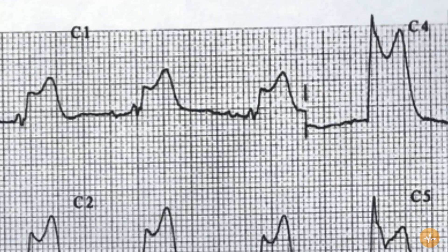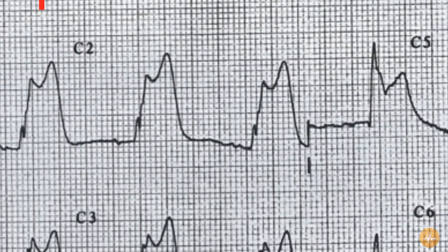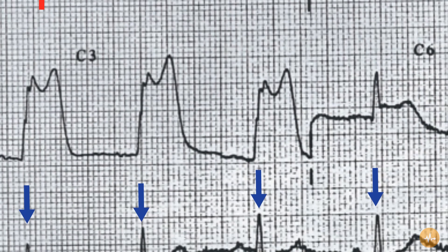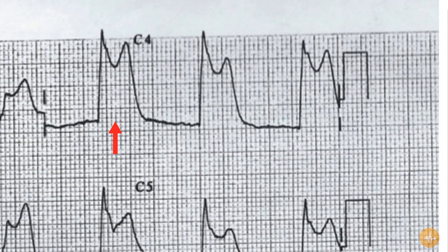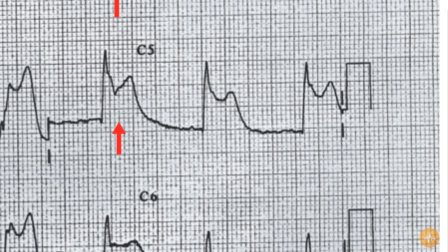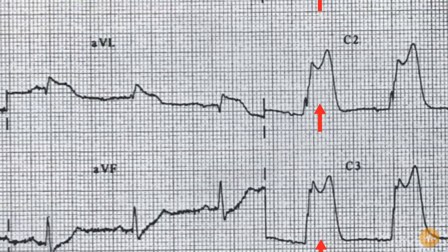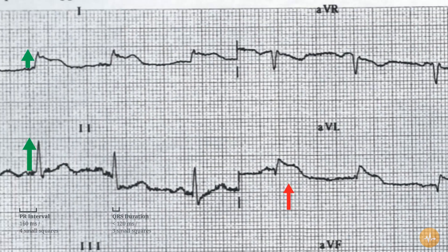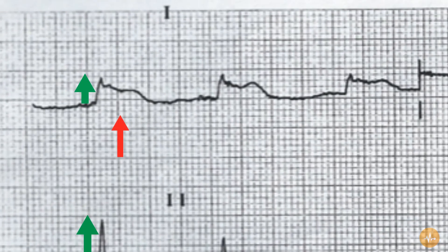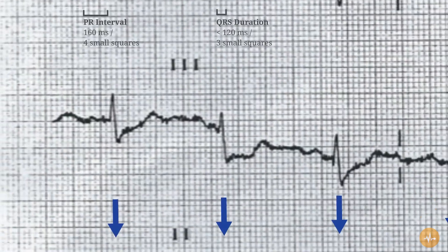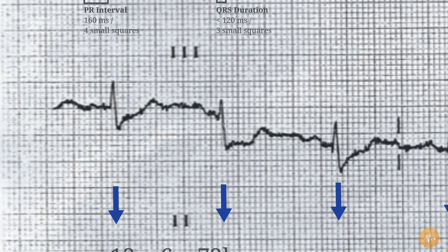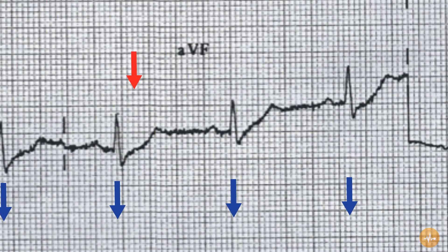There is ST segment elevation in leads V1, V2, V3, V4, V5, V6, AVL and lead 1. There is ST segment depression in leads 3 and AVF.